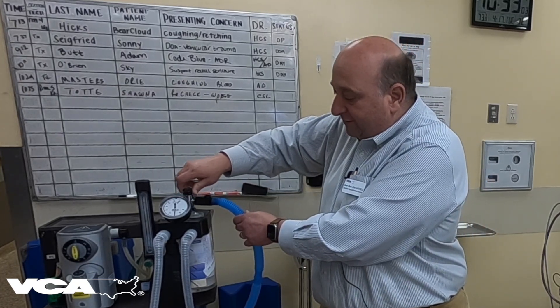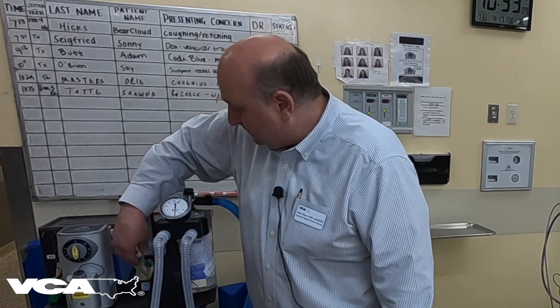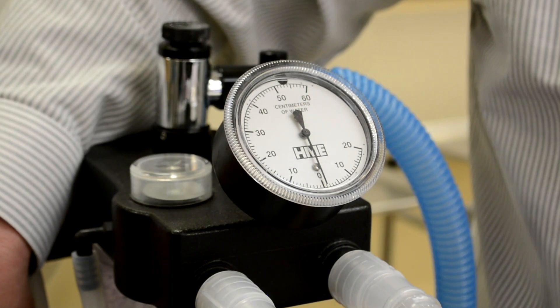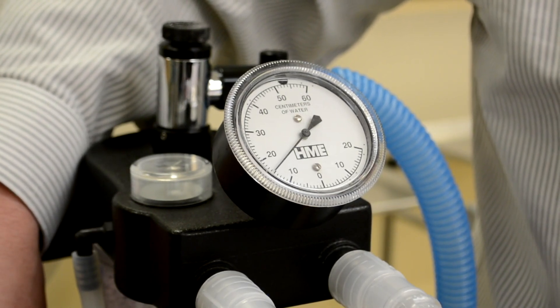So I'm going to close the pop-off valve, and then I'm going to turn on the oxygen flow, and we're going to watch the needle climb up to about 20 centimeters of water.